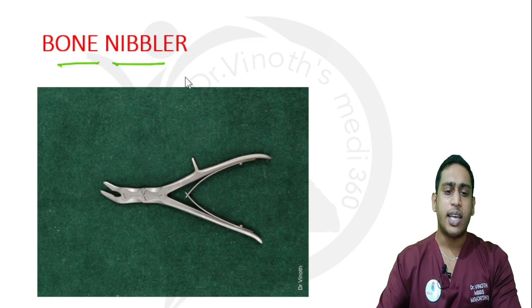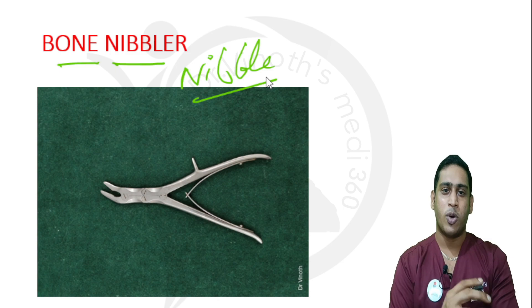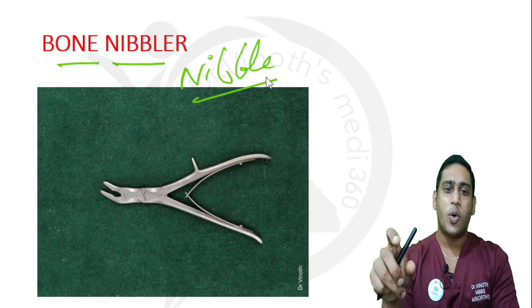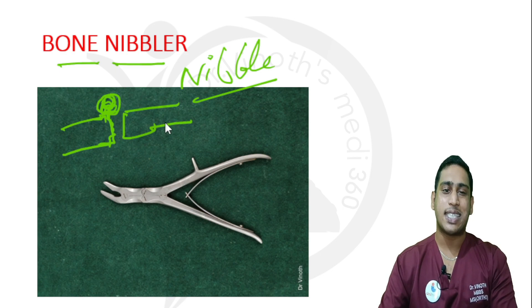This is a bone nibbler. It is used to nibble out the bone surface. Nibbling means superficially grinding out — like a mouse that does not eat food completely but superficially grinds it out. When there is excess callus at a fracture site, I need to remove only the excess callus while maintaining the integrity of the cortex. I slowly remove only the excess callus — this process is called nibbling, and that is why this instrument is called a bone nibbler.